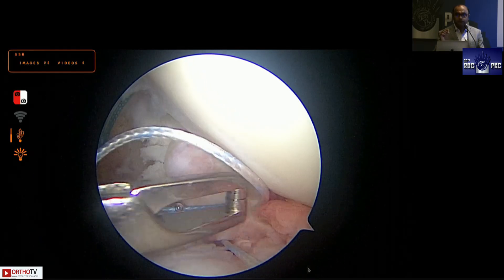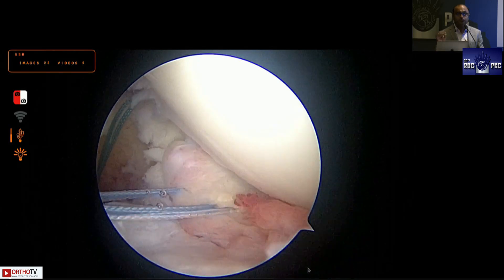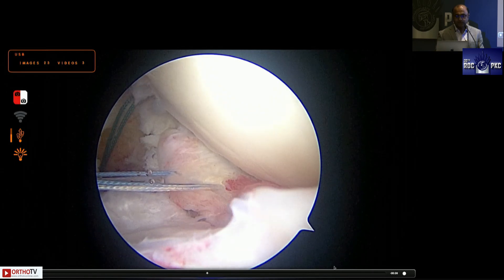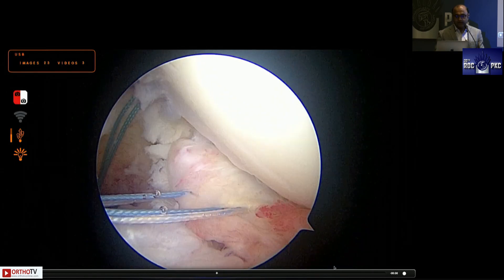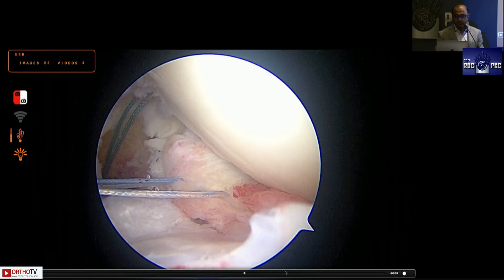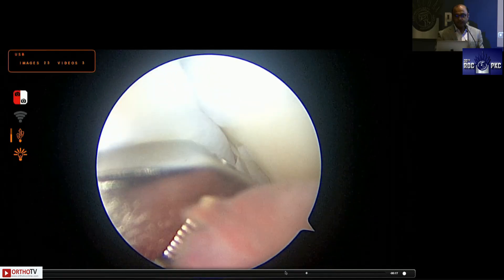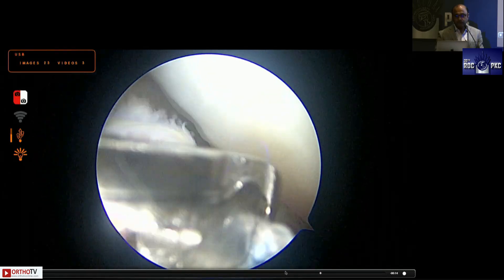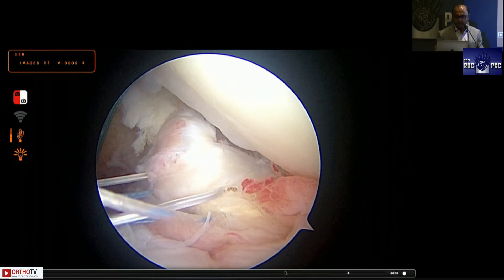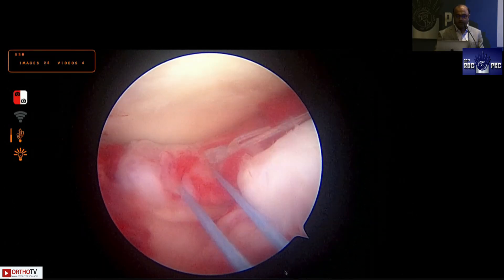Sometimes in children with parameniscal cysts, by the time you've taken out the cyst you can have a completely weak lateral meniscus root — so have shoulder anchors and shoulder instruments available for your knee cases too. You can always create a Mason-Allen kind of construct where sutures are mattress-configured and one suture goes medial to the mattress sutures, giving you a rip-stop configuration. These are the strong constructs you can create with these antegrade devices, giving you a nice robust lateral meniscus root repair.